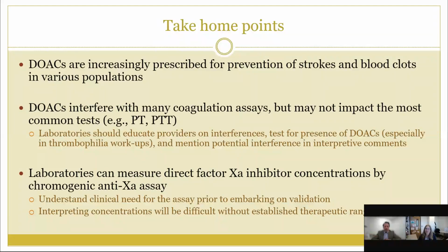Yeah, this is a great question, and one I've been considering in my own laboratory. I've been kind of resistant to the use of DOAC neutralization agents because essentially it's a modification to your assays, and so it will essentially become a laboratory developed test. So meaning that you are now responsible for making sure that the use of that product has not changed the precision or the accuracy of the test. For example, where we're considering using it is for lupus anticoagulant testing.